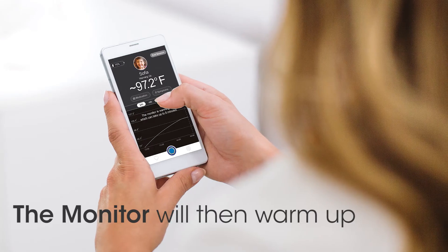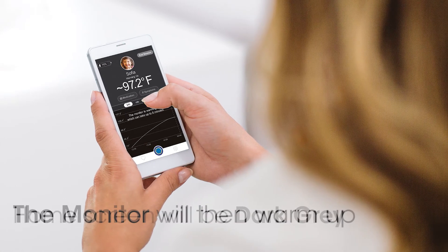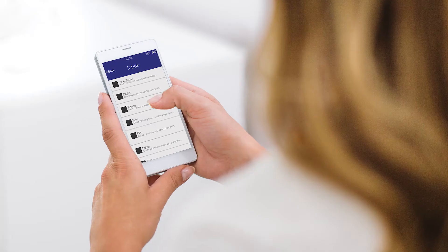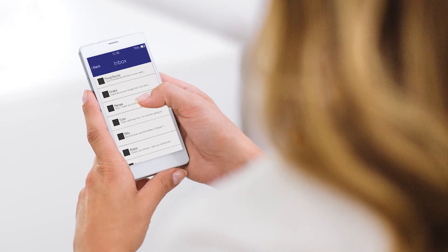The monitor will then warm up. This can take up to 8 minutes, during which the home screen color will be dark gray. Make sure your child's arm covers the sensor for accurate readings. You can leave the app while it's warming up — you'll get a notification when it's done.